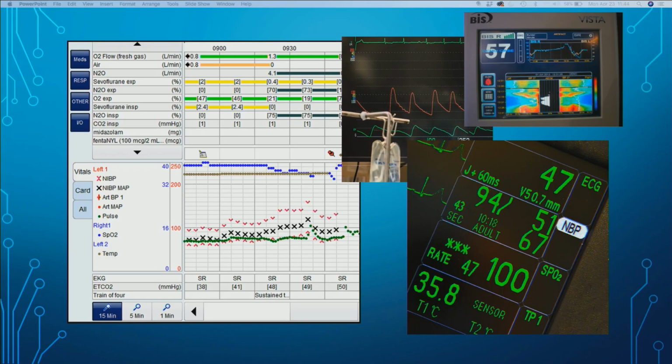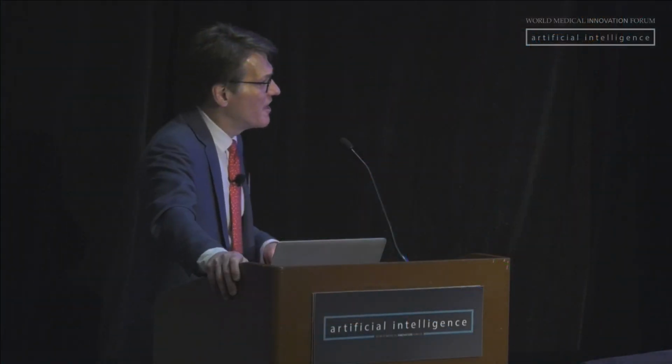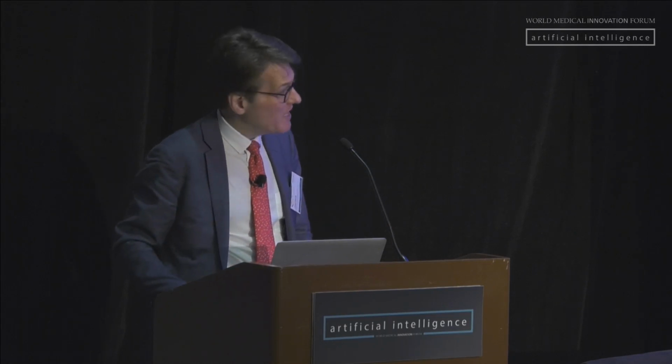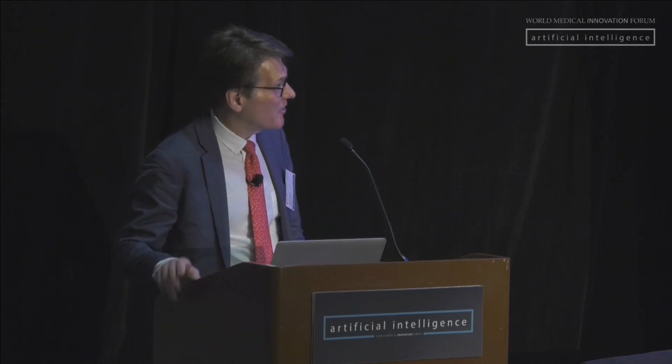And this is kind of what it looks like. We're doing a scan constantly. The left is the anesthesia record, kind of plotting things. We see the physiologic waveforms. To the right, upper right-hand corner is the compressed spectral array, the BIS monitor, or depth of anesthesia monitor. And down to the right is just a general plain old anesthetic, the minimum monitoring that we would have: electrocardiography, non-invasive blood pressure, heart rate there, temperature, and then some EKG ST segment analysis.